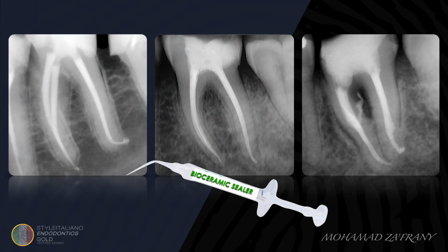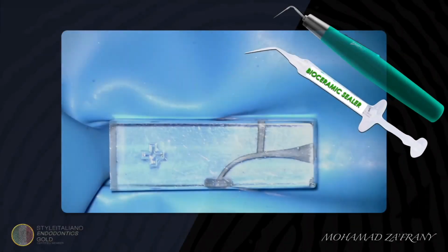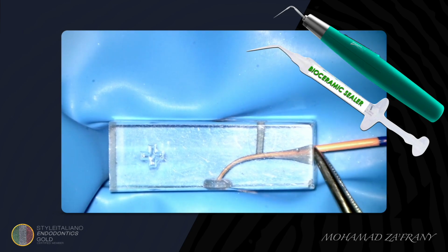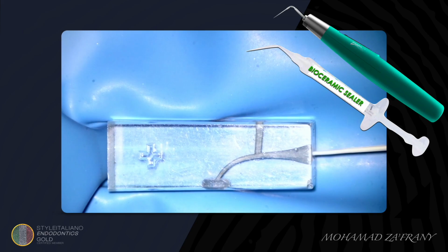Here are some cases that were treated with bioceramic sealer as the obturation technique. And here we can see fast healing in cases where the bioceramic sealer obturation technique was used. Simply on this model, I'll choose a bioceramic sealer obturation technique with single cone. No need to have a good tug-back because it's sealer-dependent obturation, but for sure we need the master cone to reach the working length.